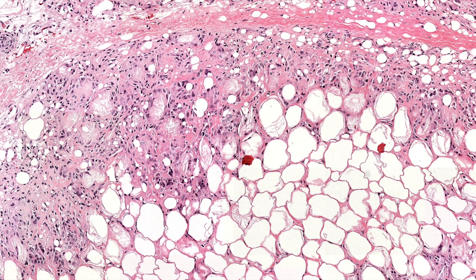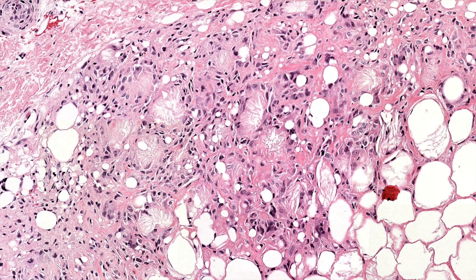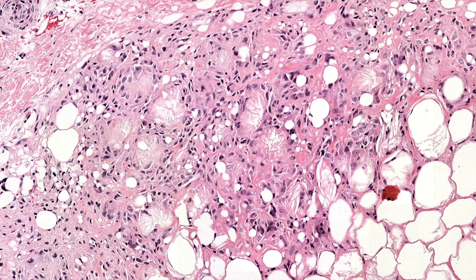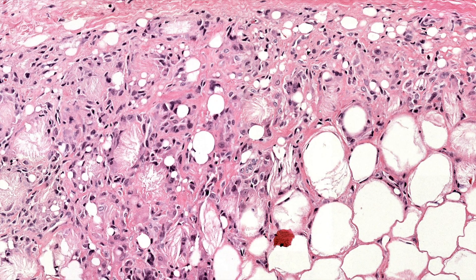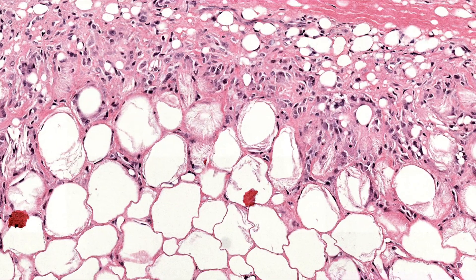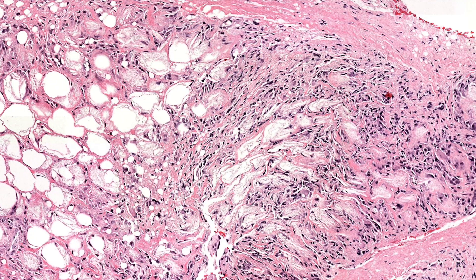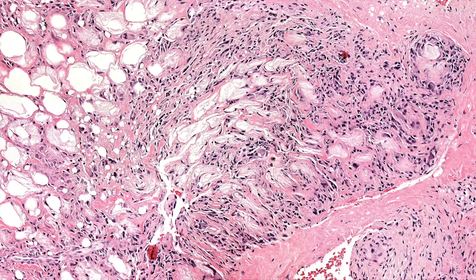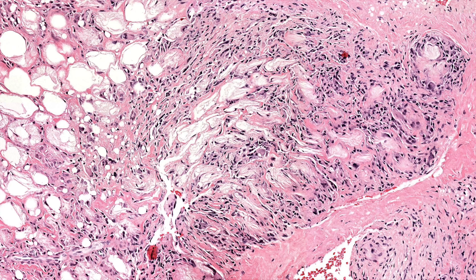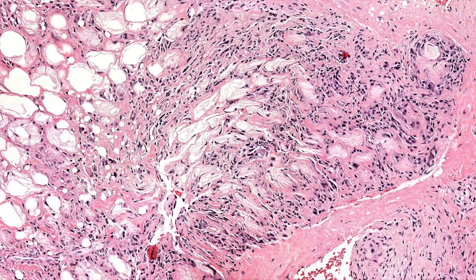The crystals are these little spike cleft-shaped, cleared-out crystalline spaces. What kind of crystals are these? They are lipids that crystallize out — my understanding is they are thought to be triglycerides or fatty acids.